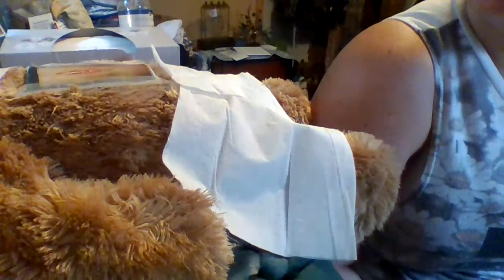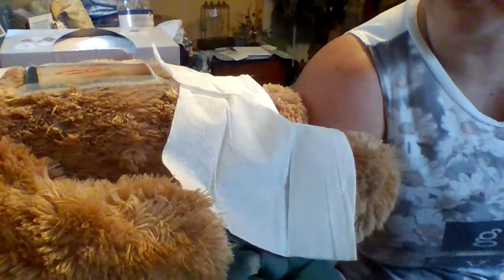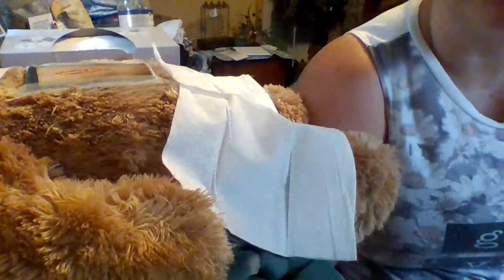So now that I have cleaned my wound, I'm ready to put on a new dressing. Now, based on the type of dressing that you're doing, you can either do dry or you could do wet to dry. I'm going to be doing dry because I can't really pack my wound.